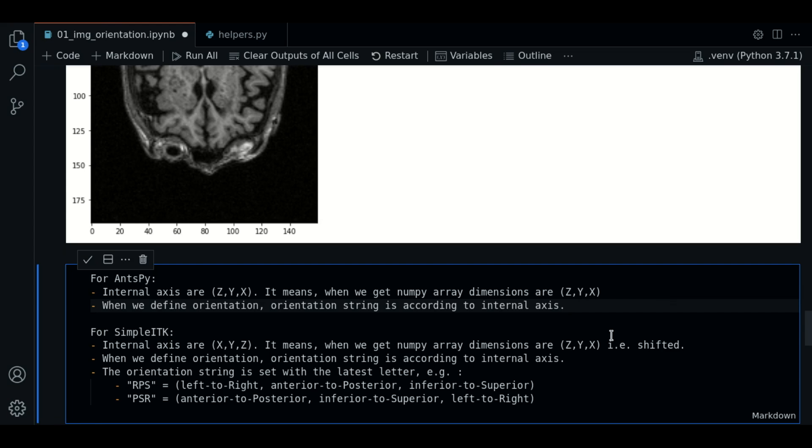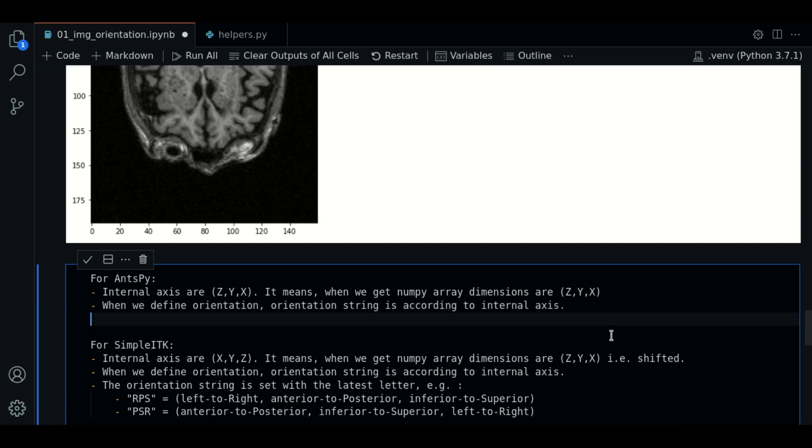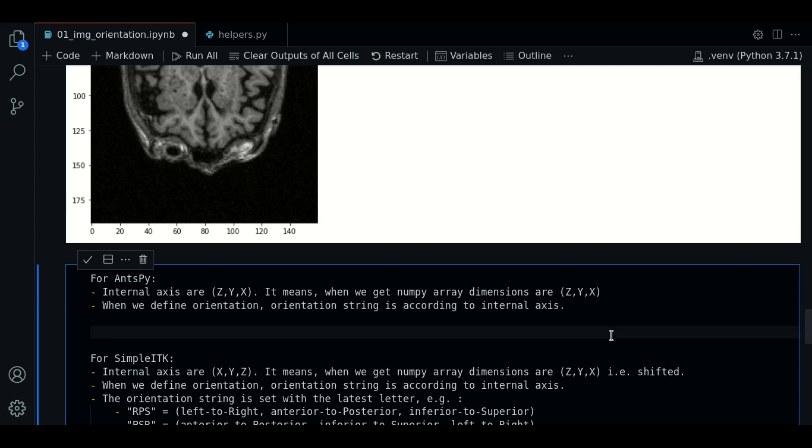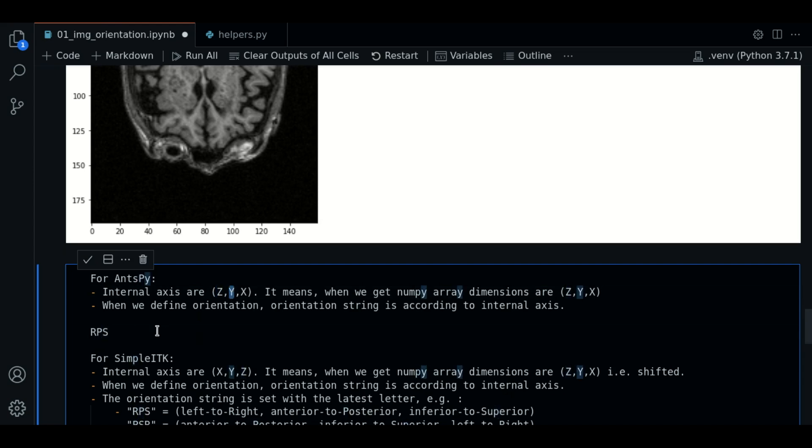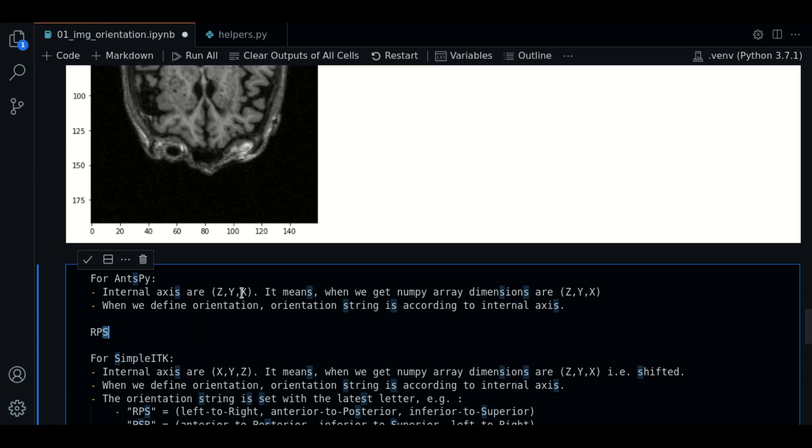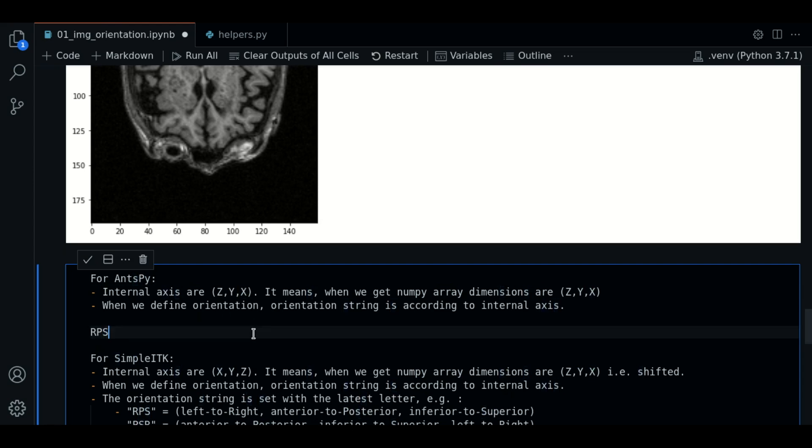And when we define the orientation string, orientation will be according to the internal axis. For example, the string RPS, the first letter will dictate the orientation of the first axis. This letter will be to the second axis. And so on. We have already talked about this.